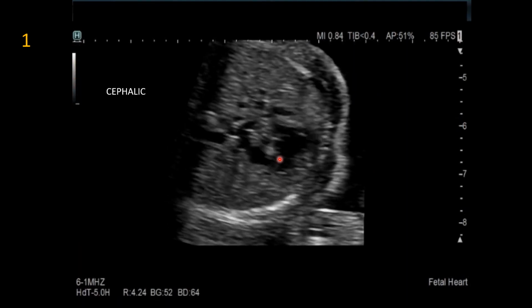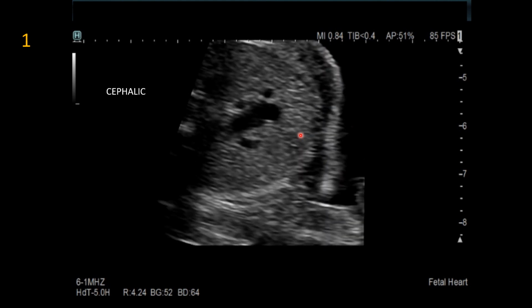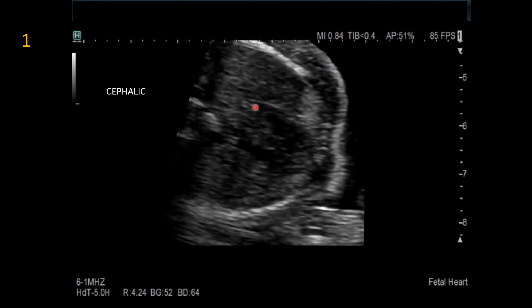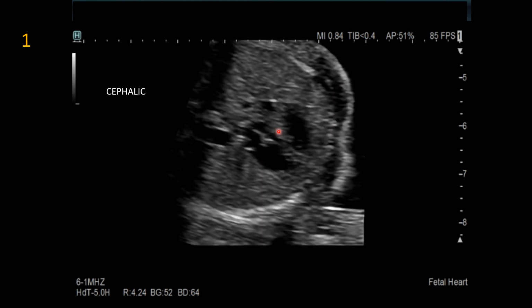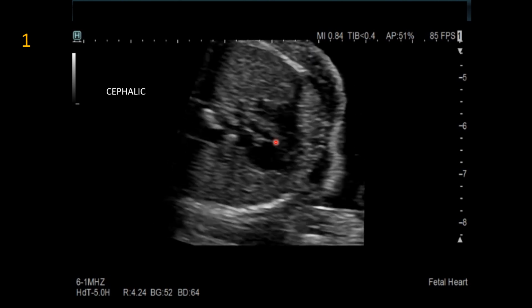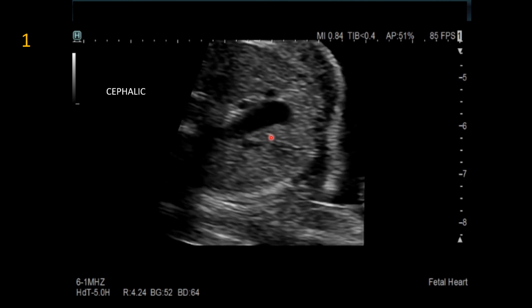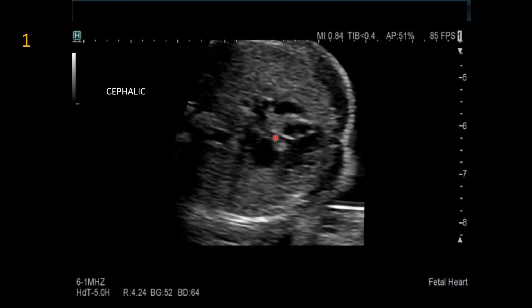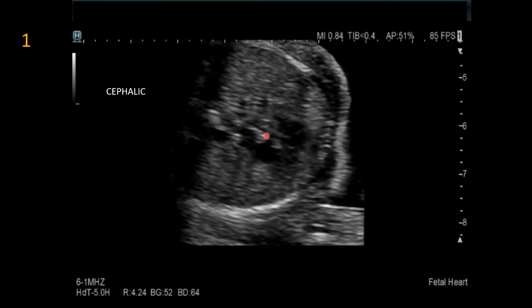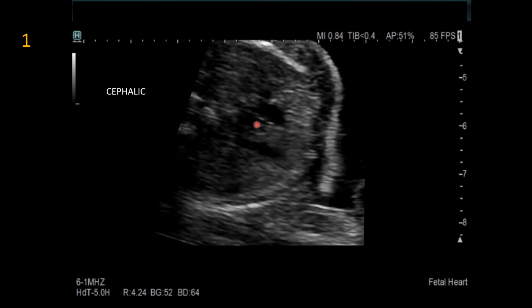With 2D, again, we're looking at the outflow tracts. Here's the dominant outflow tract that comes off of the left side of the heart, and again is the aorta, and so it does not bifurcate. But if you look closely right next to it here, the smaller vessel, there's a smaller outflow tract right here where this pointer is. This is the pulmonary valve here. You can see some movement in there, and then you faintly see a bifurcation here. Okay, and so that is the pulmonary artery.